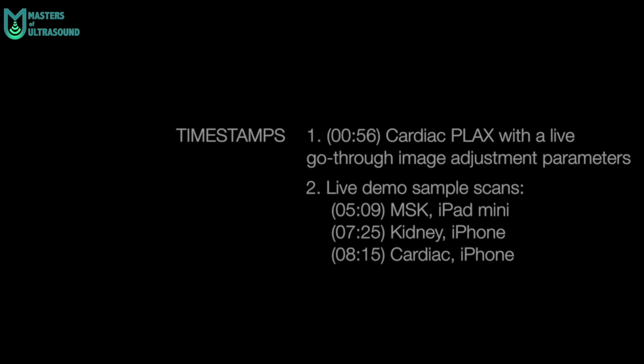I will divide the video in 3 parts that you can appreciate here, as well as their timestamps. First, a live go through the image optimization parameters over a cardiac parasternal long axis view. Then 3 live demo samples.